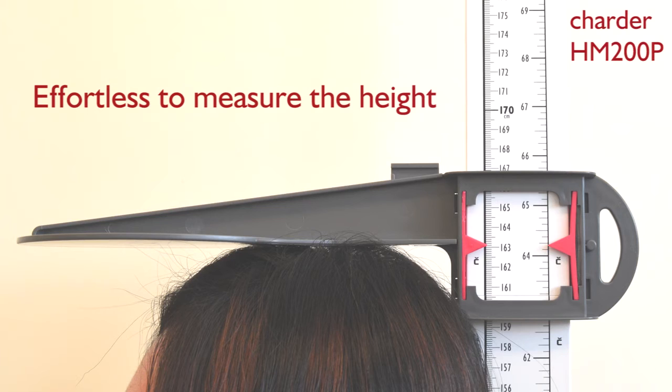Let the head stopper touch the patient's head. Read the height result from the red arrow direction. Measurement is easy and completed.